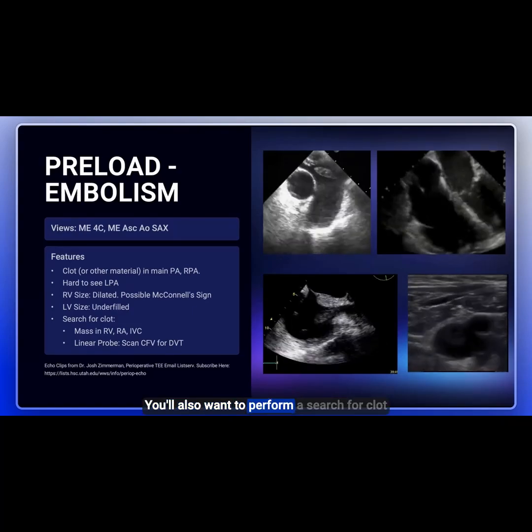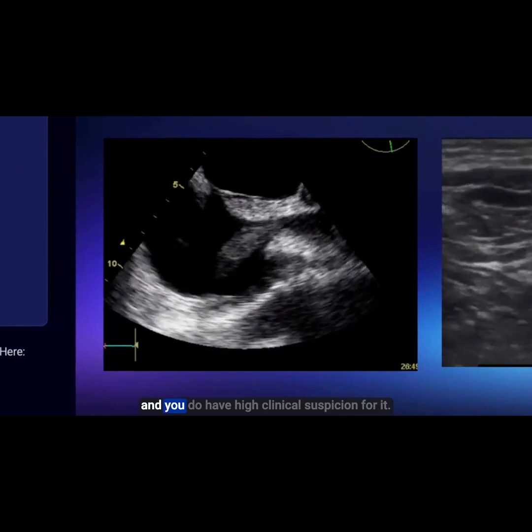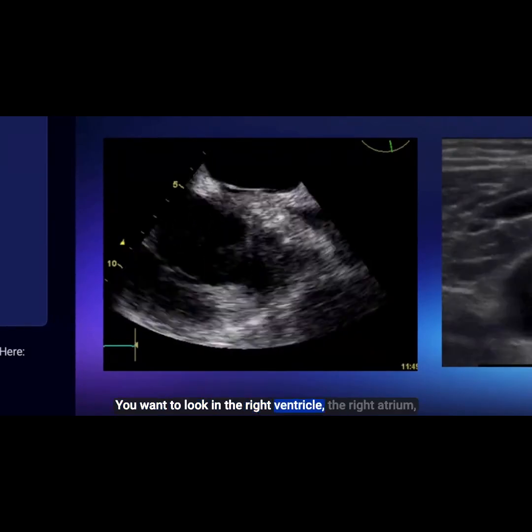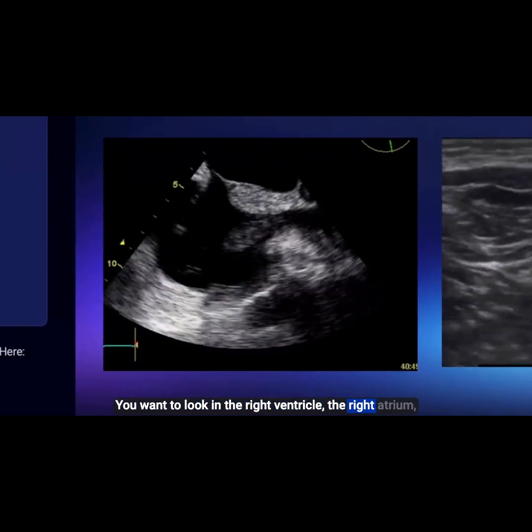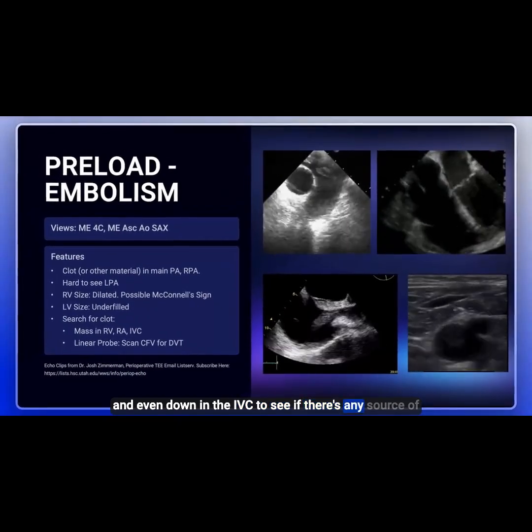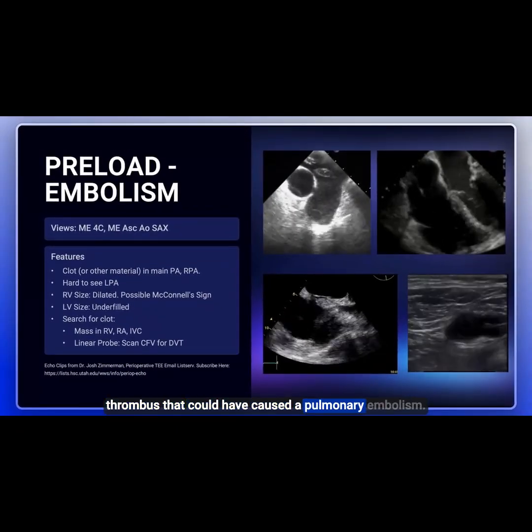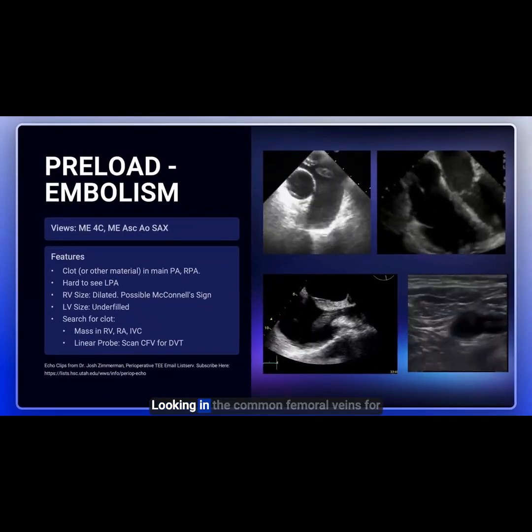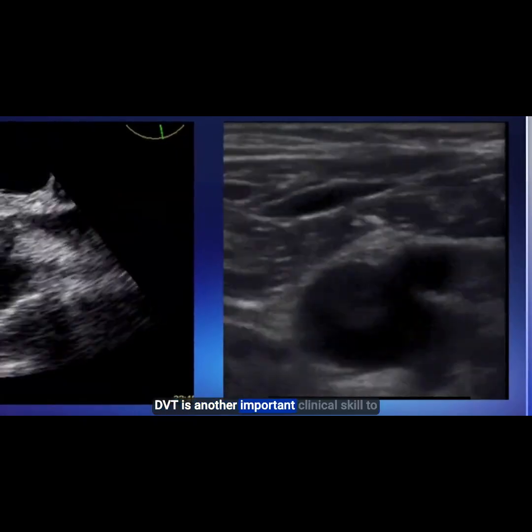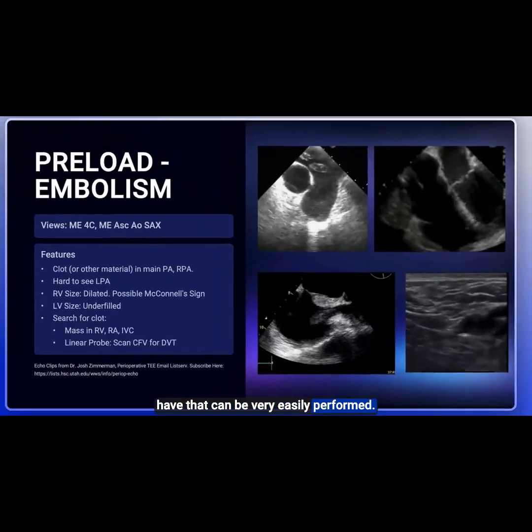You'll also want to perform a search for clot. If you don't see it in the pulmonary arteries and you do have high clinical suspicion for it, you want to look in the right ventricle, the right atrium, and even down in the IVC to see if there's any source of thrombus that could have caused a pulmonary embolism. Looking in the common femoral veins for DVT is another important clinical skill to have that can be very easily performed.